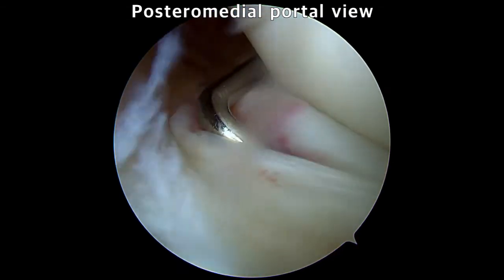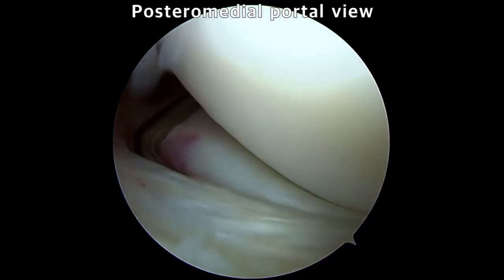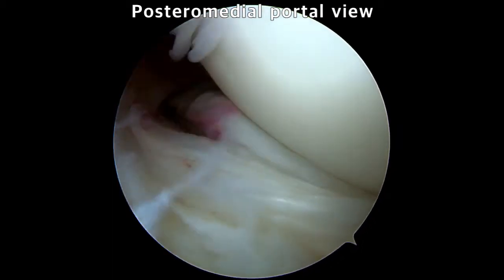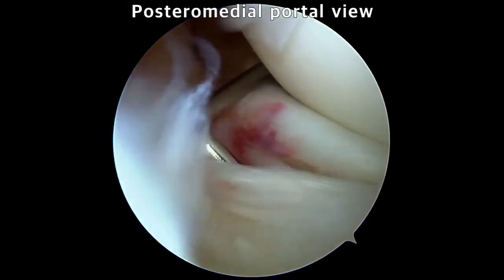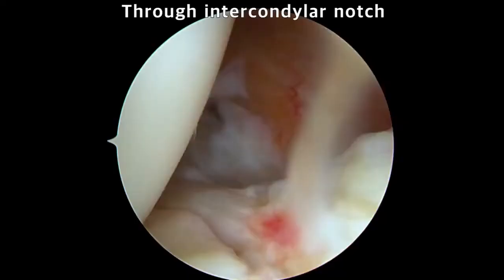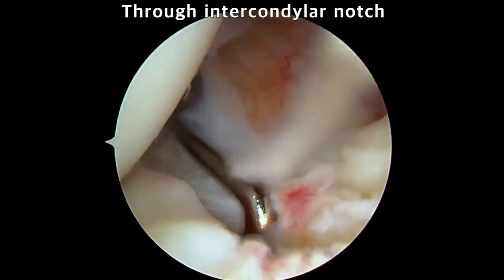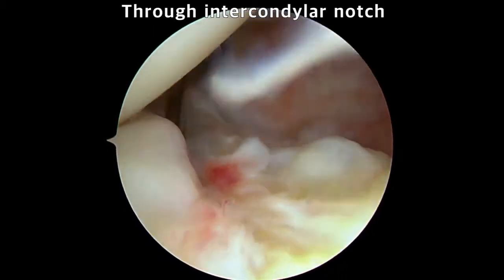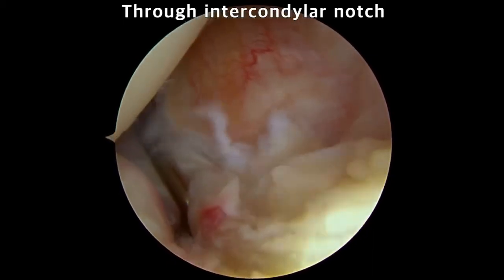Routine arthroscopic examination is done using the anteromedial, anterolateral, and supermedial portals. To confirmatively show the ramp lesion, an additional posteromedial portal is made, which is not necessary in our technique. The suspected ramp lesion can also be examined with posteromedial visualization by diving the arthroscope deep into the notch between the PCL and the medial femoral condyle.